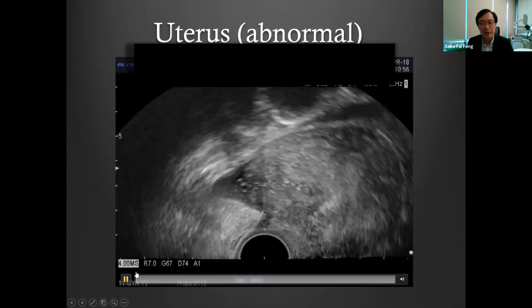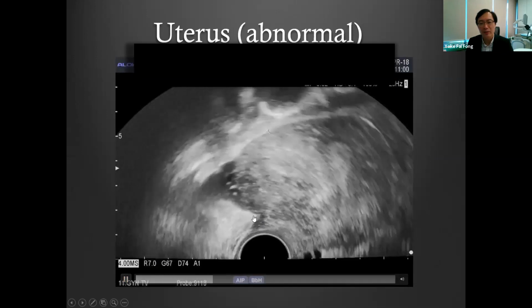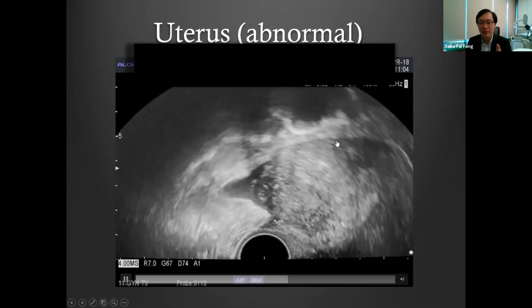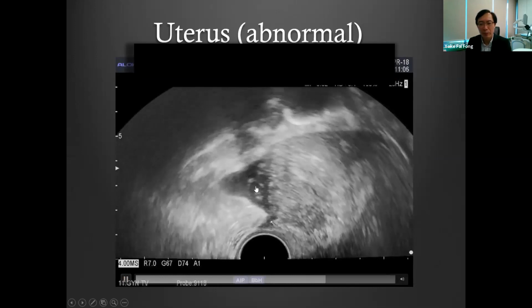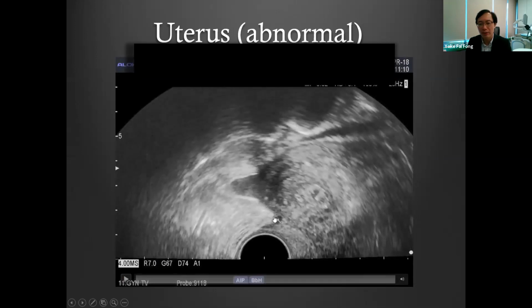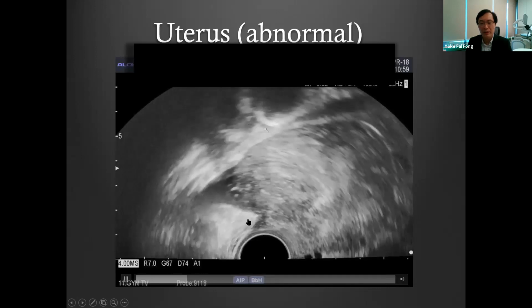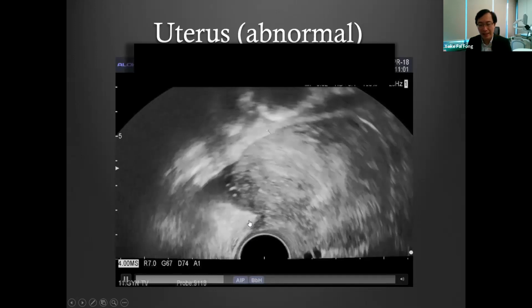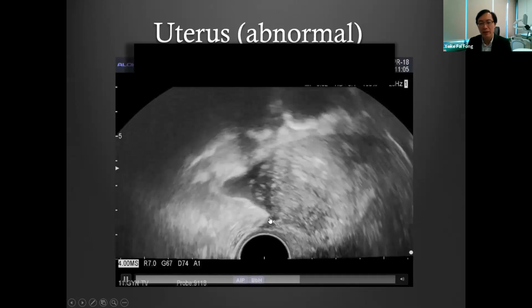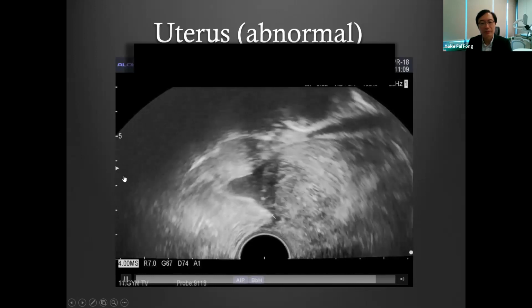This is a scan picture of the uterosacral ligament that is stuck over here. So although the front of the uterus here is nice and smooth and sliding, even to the pouch of Douglas there's a space over here. But here you can see the uterosacral ligament is stuck to the back of the uterus. It is thickened, it is stuck to the back. There's less elasticity and it doesn't move that much. So this is the USL here that's stuck to the back of the uterus.